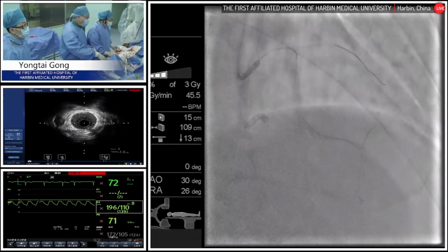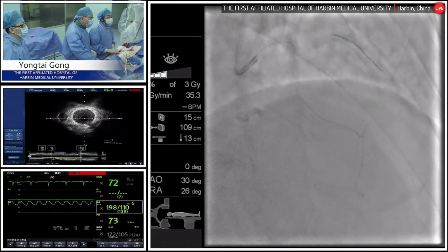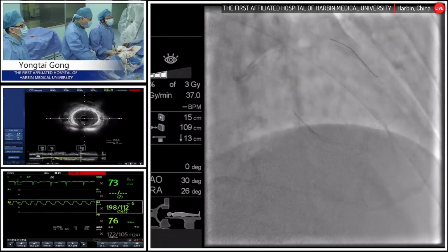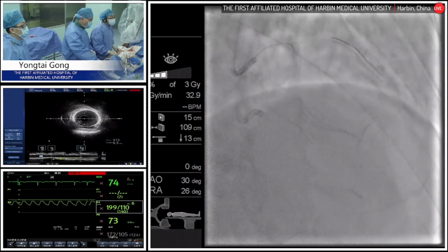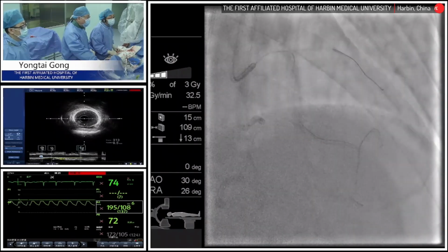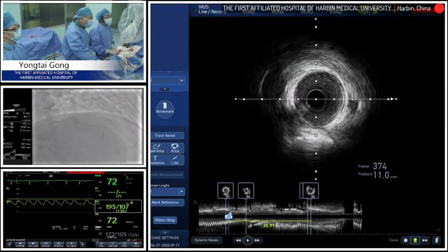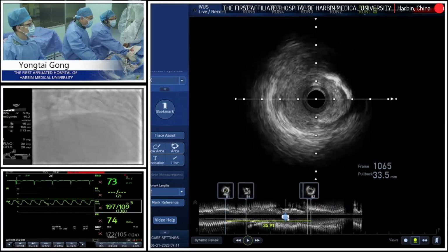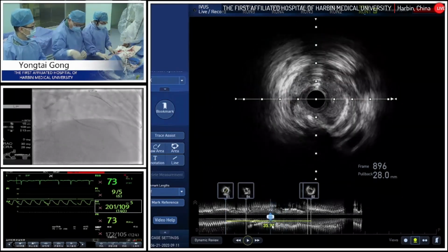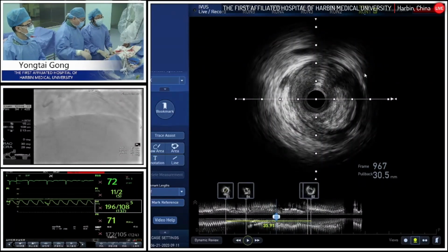Okay, let's take some time to review the IVUS images of this patient. I think it is of good importance in this patient to check the imaging. This is the circumflex. We can see the pullback of the circumflex with a diffuse severe stenosis. This is a relatively 2.5 to 3.5 vessel in the mid part of the circumflex. And this is before the stenting, after the pre-dilation, since this is a very severe, heavy plaque burden and a long, relatively diffuse lesion.